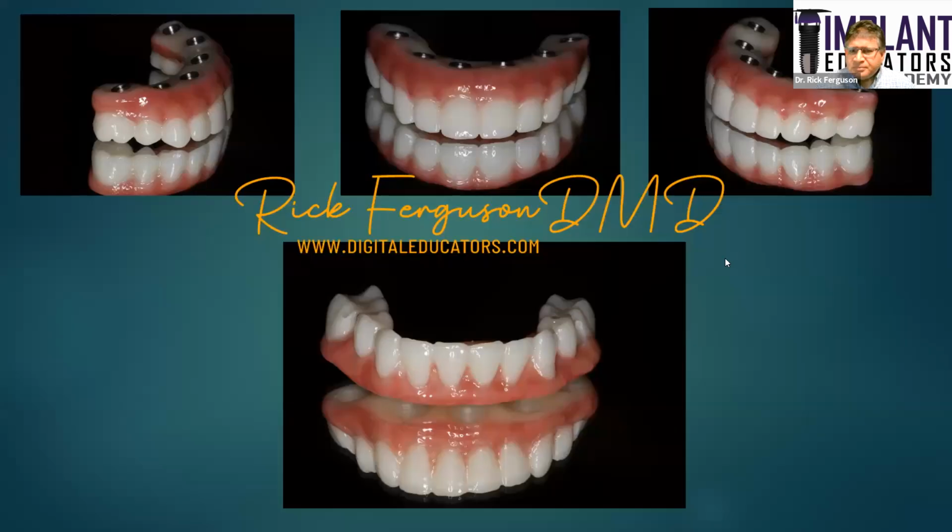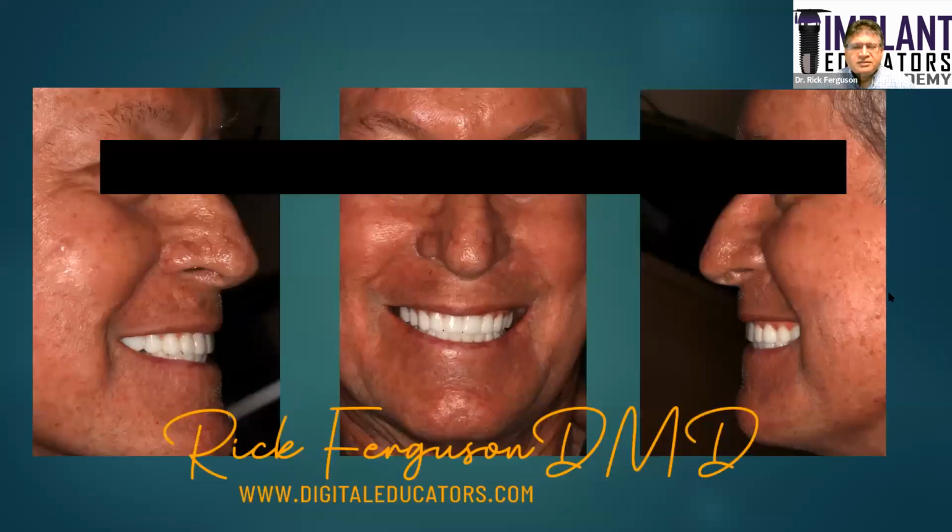All right. And then once we did the upper and then verified everything with the patient's function and aesthetics and so on, we're able to duplicate that in zirconia. And this is the final smile for that particular patient, which we milled in-house as well.